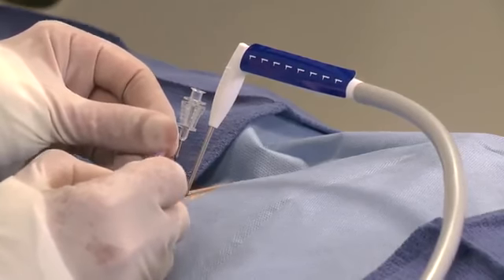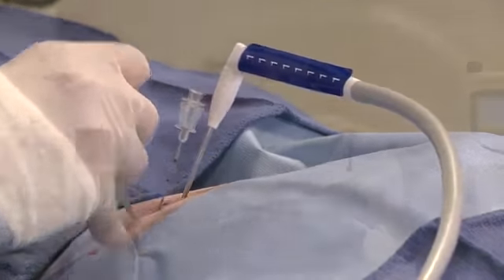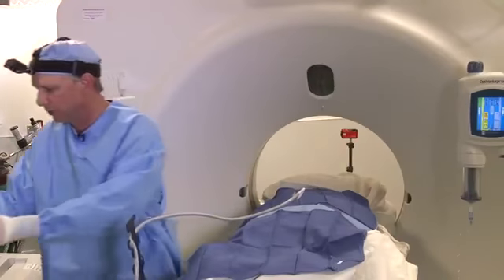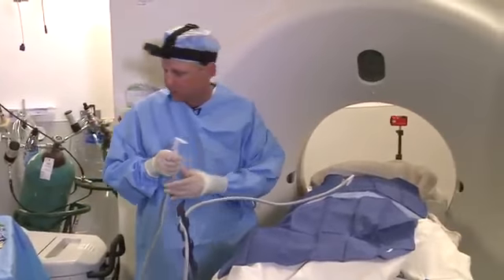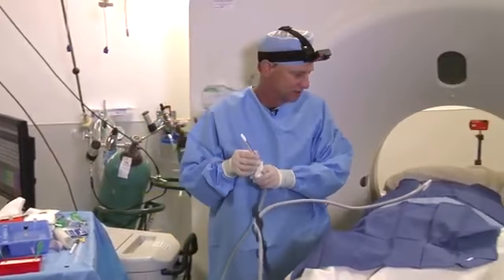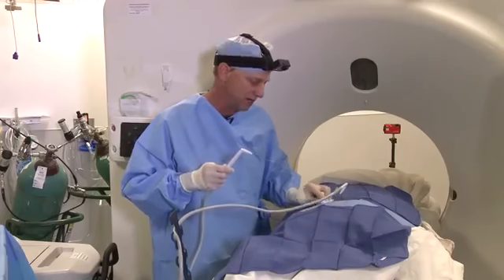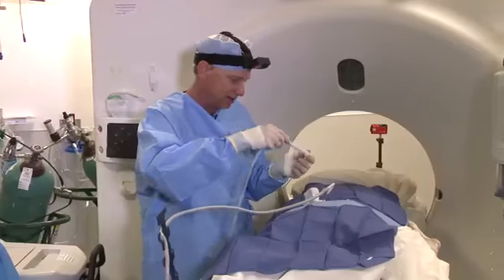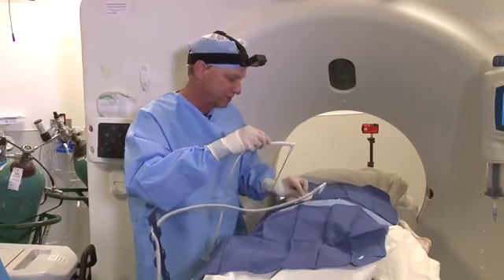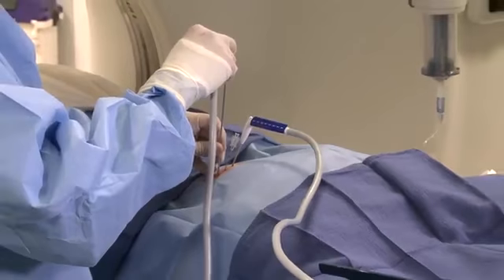I'm going to remove this marker needle, make a little nick with the 11 blade, and we'll use the second probe that we've already tested. I should say that as you're beginning this procedure, it's probably easier to test probes one at a time as you need them. That way they're not in your way. And that's certainly, you can see, keeps things cleaner for you and one less thing to think about.